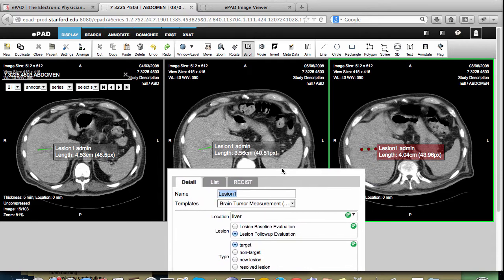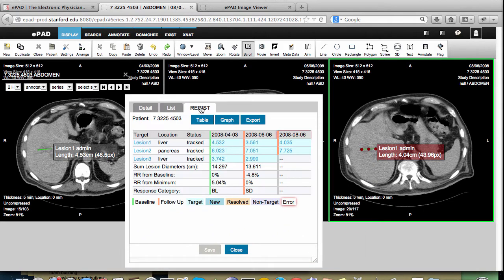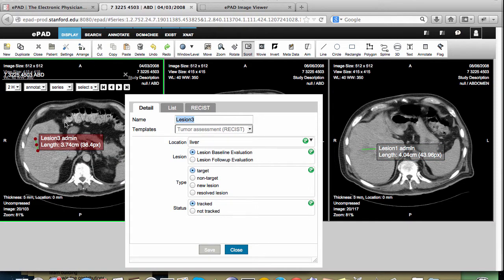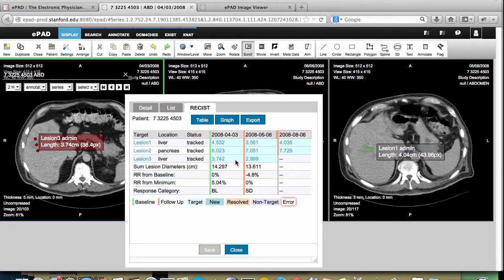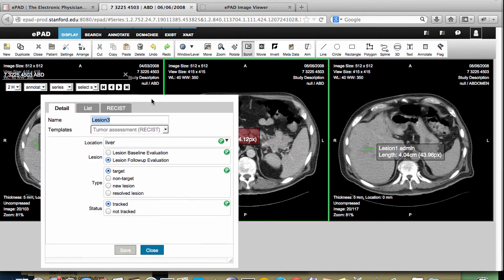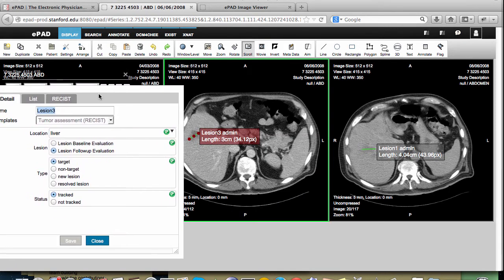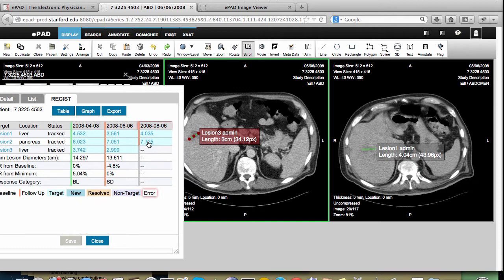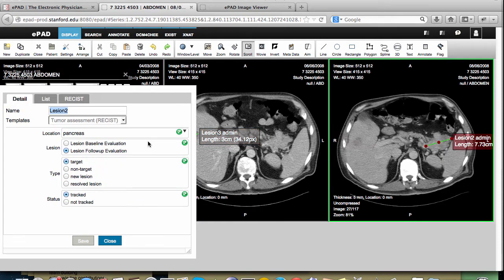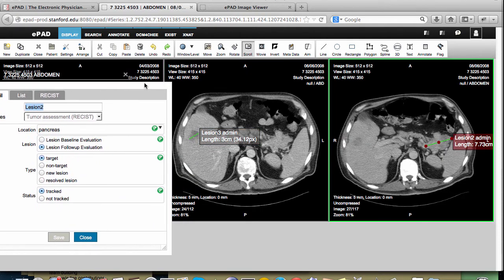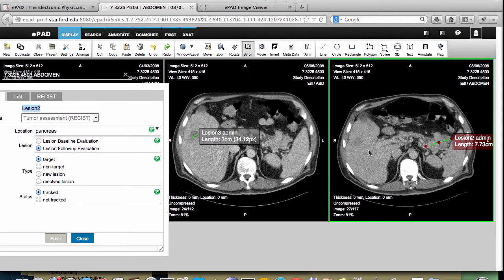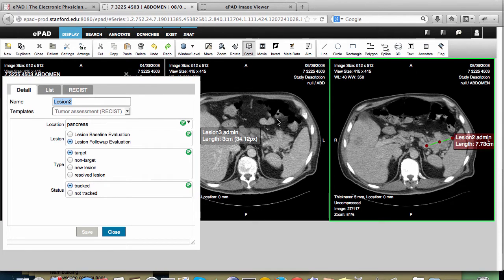Now let's look at the current lesion that we're annotating. We can see lesion 3 in the first time point, and we can see lesion 3 in the second time point. So we want to find lesion 3 in the latest study — it's right here.